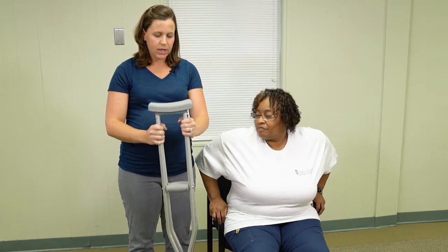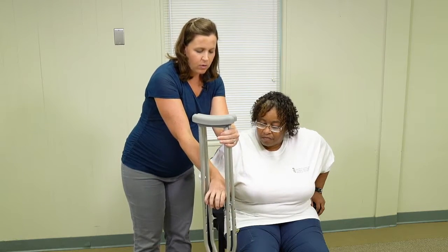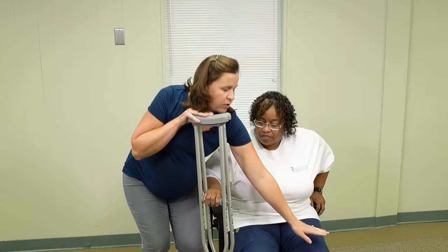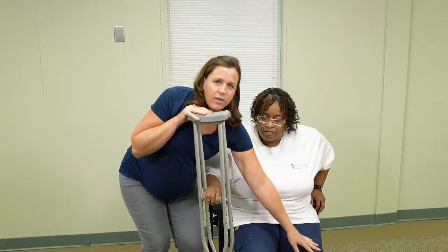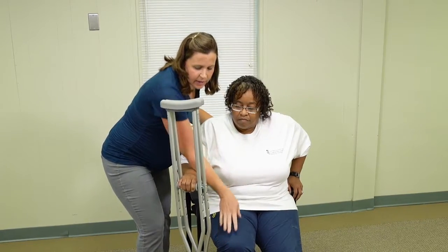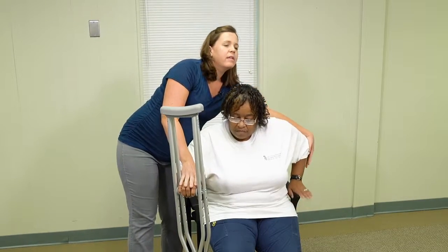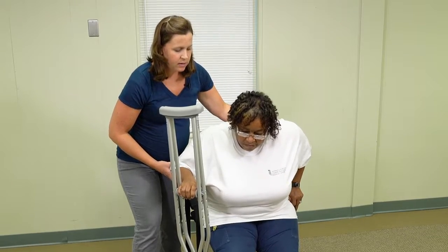With the crutches, you're going to put both of them together and you're going to stick your hand on the grips here. When you come up to standing, whichever leg is affected, you can put it out in front of you a little bit to help take some stress off of that leg, whether it's the knee, the ankle, or the hip. Next, you're going to push through your unaffected leg, push through the hand that is on the crutches, as well as the hand that is on the armrest, and slowly come up to standing.